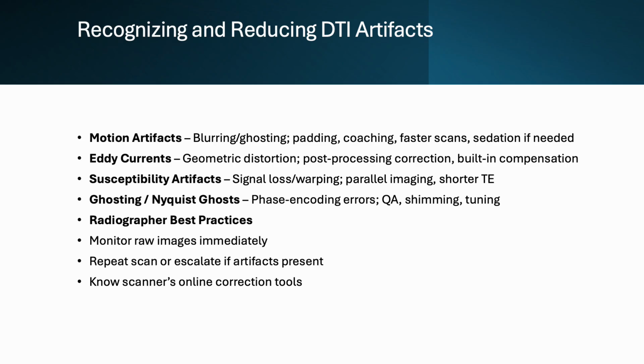So in DTI, artifacts are common and can easily compromise the diagnostic value of the study. So it's crucial to recognize them and know how to address them. I did not include any images of the artifacts in these slides, so please make sure you go and look for these artifacts so that when you see them, you can spot them and know that they are actually artifacts and know how to deal with them and to correct them.